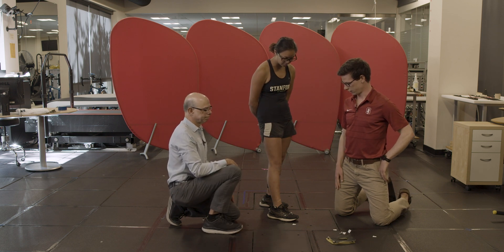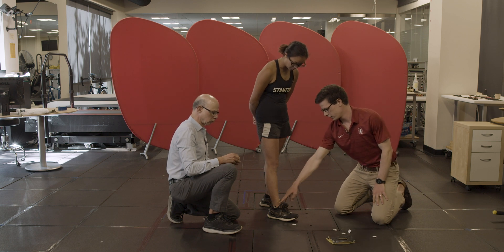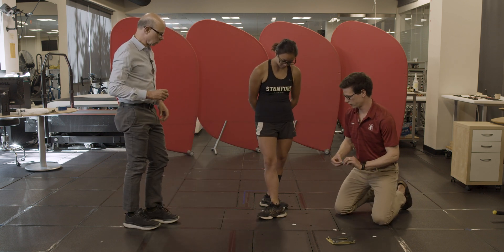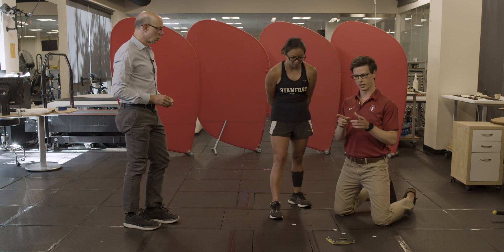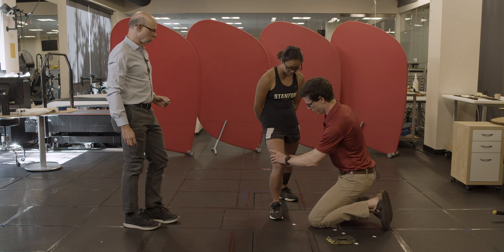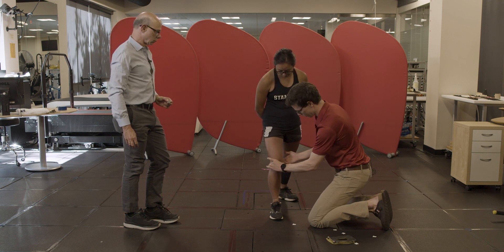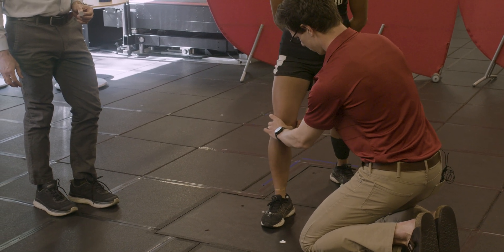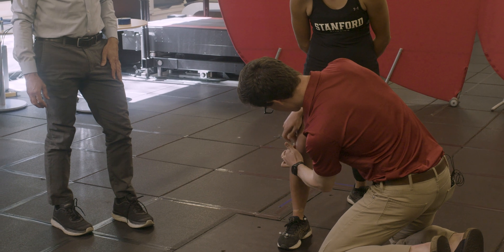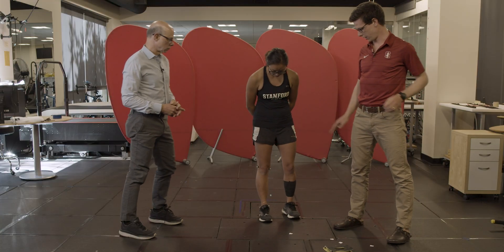Now we want to characterize the shank. If we assume the ankle markers define the fixed axis of the ankle, those markers are fixed in both the foot and the shank, so we can use them for both. But we also need to define the knee joint axis, so we put two markers on the medial and lateral femoral epicondyles — the most prominent points on the outside of the femur. It can be helpful to have the patient go through a range of motion to palpate, since the IT band can make it hard to find the lateral epicondyle. Now we can establish anatomical reference frames for both the foot and the shank.